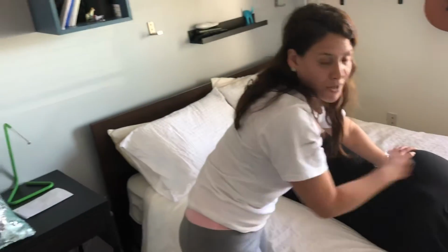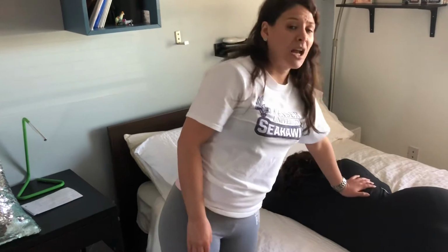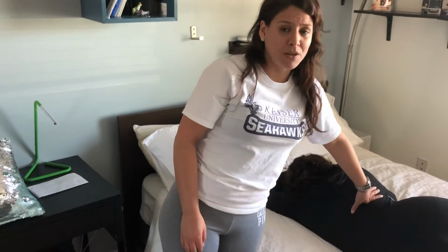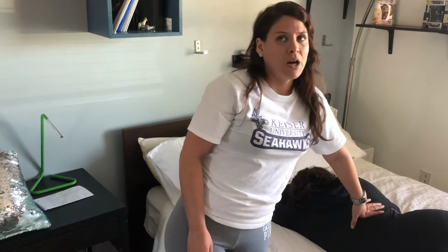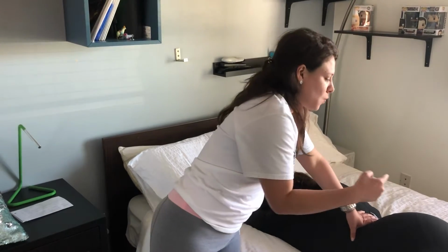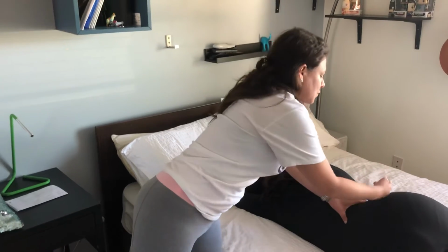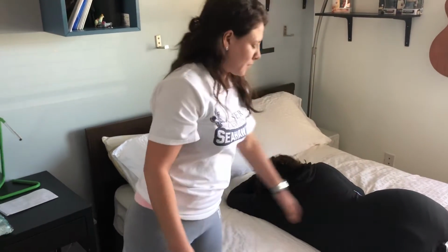This leg goes a little bit open, so we can do the barium enema tip insertion. This position allows the abdominal muscles to relax and decreases abdominal pressure. When they insert the barium enema tip, it has to be 1 to 1.5 inches toward the umbilicus.